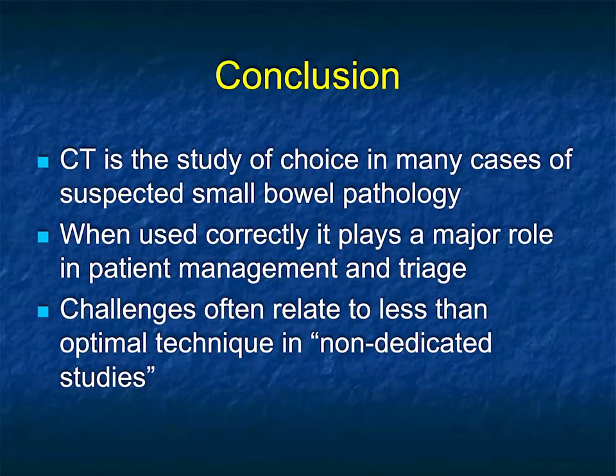So concluding then, we've looked at a range of small bowel obstructions. We looked at how we do the studies, how we interpret the studies, some of the classic findings, some of the challenges. And I hope that looking at all of these cases will give you a better understanding of how we need to look at small bowel obstruction and how we can be of use to our patients and our referring clinicians. And with that, have a great day.